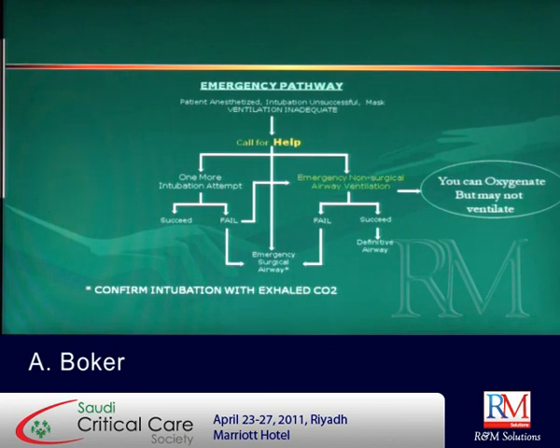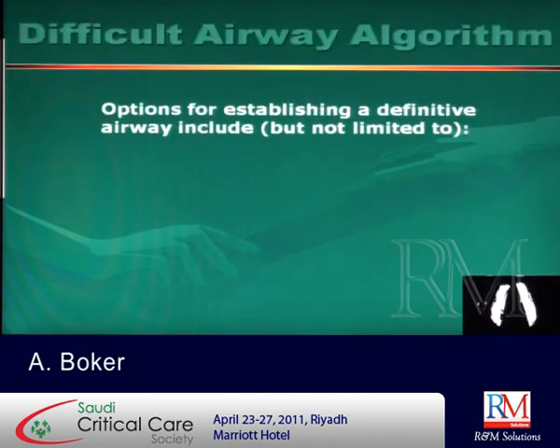Is it a good thing or bad thing? It's good and bad. It's good only in an emergency. It's very bad because it's one of the equipments that you cannot practice on normal people. It's not part of routine care, like LMA you could use for routine care. But the combi tube is very destructive. The morbidity is very high. It's actually disappearing because there are so many other choices now. But it's a classical choice here.